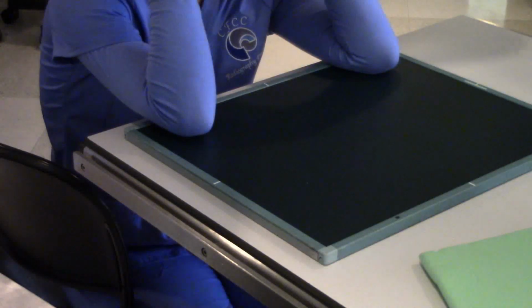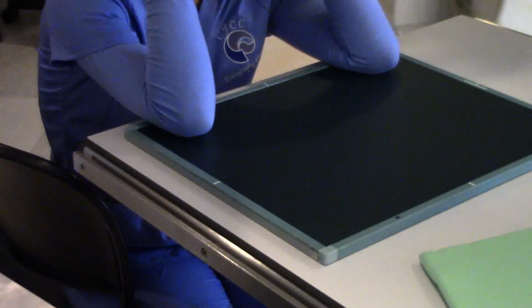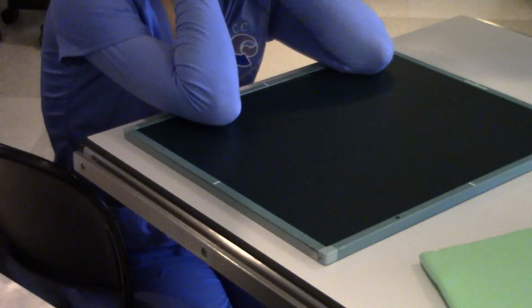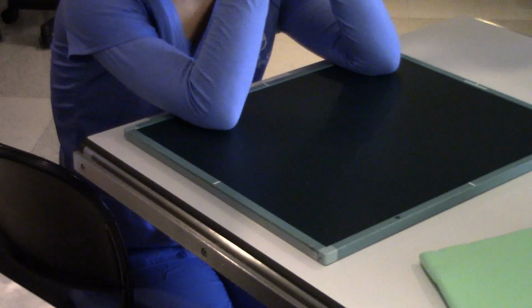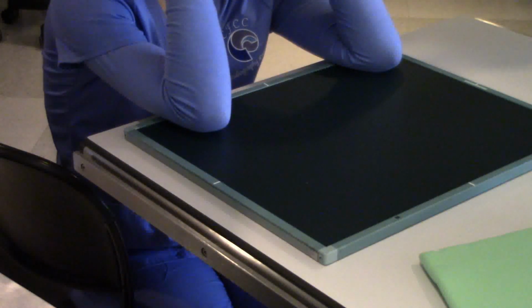If you shoot a preliminary x-ray and you see a broken bone, then you know, okay, I can't manipulate this person's elbow at all. But if you see that there's not a broken bone, then you can ask them, ma'am, do you think you might be able to straighten your arm out a little bit? But we don't want to do that if it's going to wind up hurting them worse. Just get them to do whatever they can. And if they really can't extend their elbow all the way, then you do the double shot like we showed you. And what's the next thing?